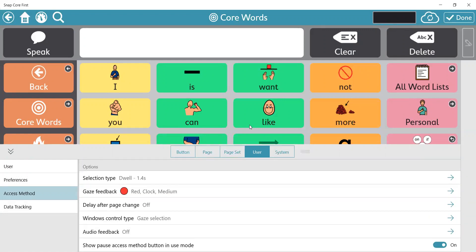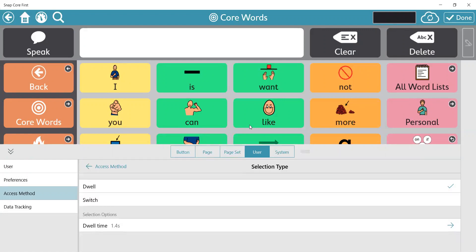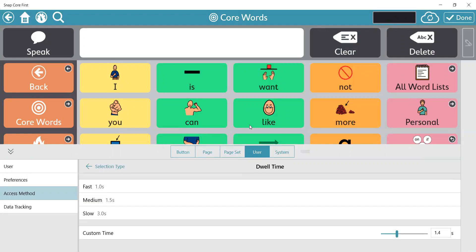I'm going to set my dwell time — I'll click on dwell time and set it to one second, which is fast, and then I can go back out.